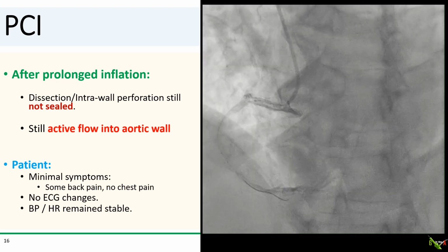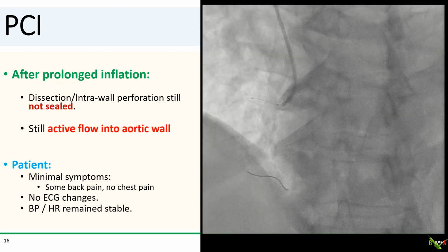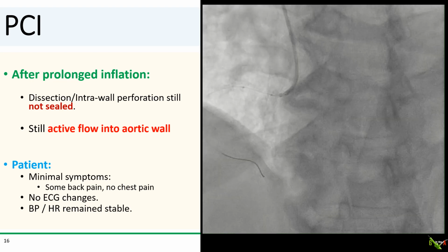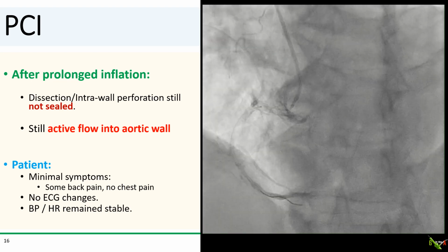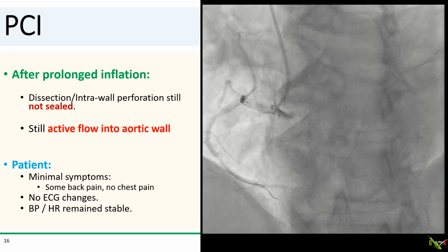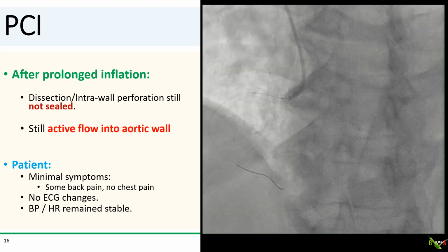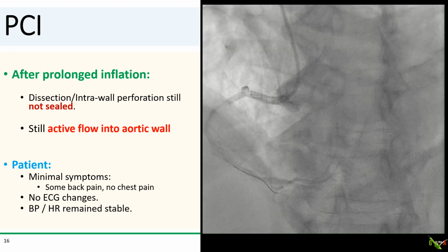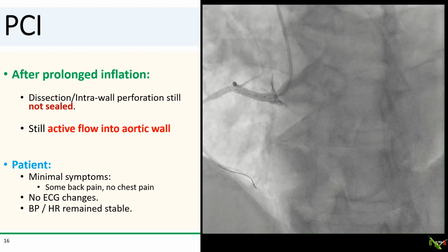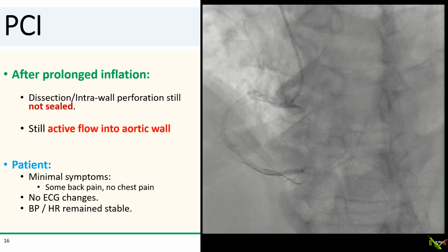But after the prolonged balloon inflation, the dissecting intra-wall perforation was still not sealed. We can still see active flow into the aortic wall. How was our patient doing? Well, other than some relatively mild back pain, he was actually remarkably stable. He had no chest pain, there were no ECG changes, and his blood pressure and heart rate remained the same. We were probably more tachycardic than the patient.